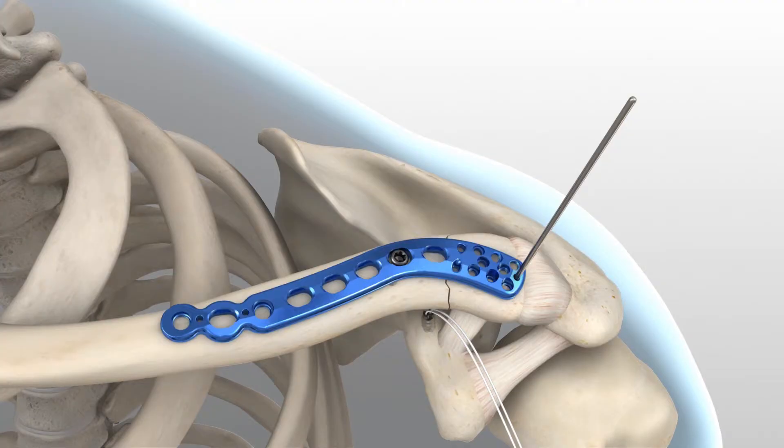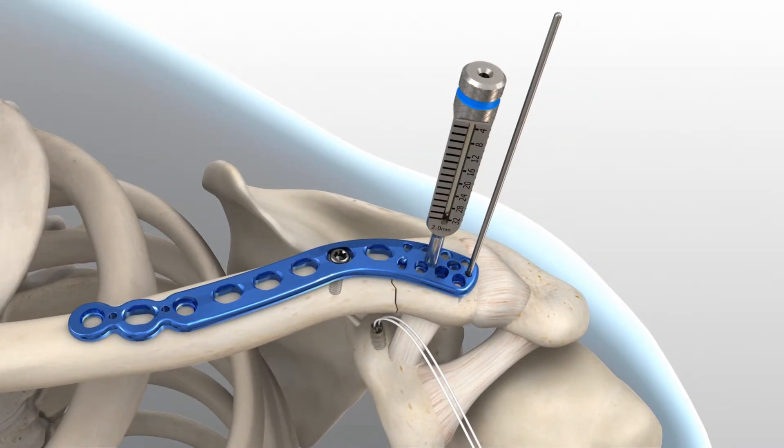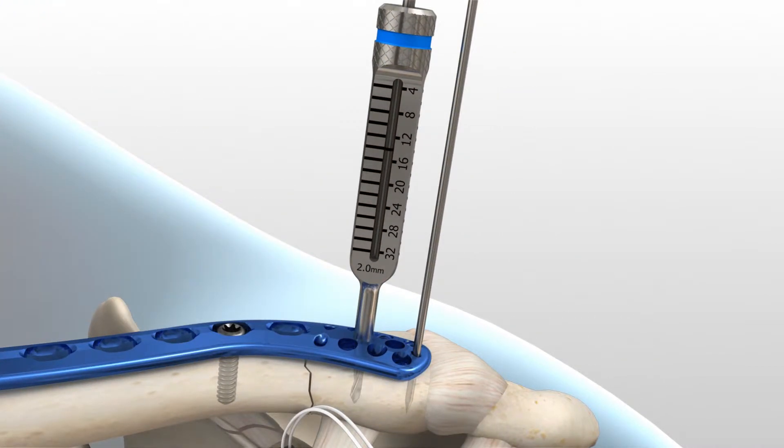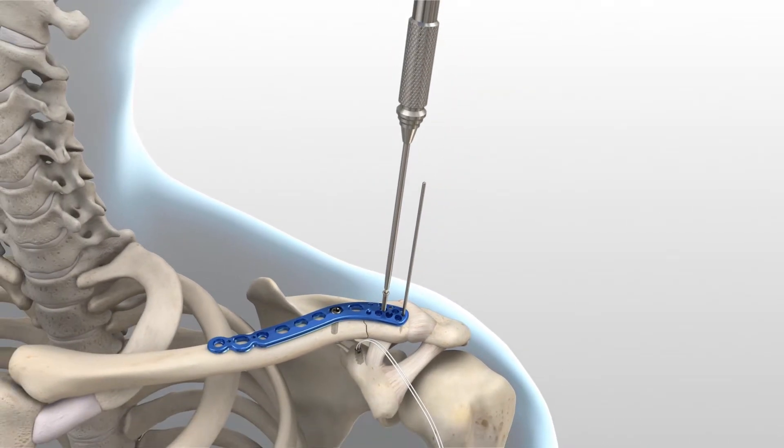To insert the distal screws in the plate, begin by securing the plate to the distal fragment by inserting a 2.3 mm non-locking screw through the medial-most center hole. Place the 2.0 mm locking drill guide into the center hole and turn clockwise so that the guide fully threads into the plate. Insert the 2.0 mm drill and advance to the desired depth. Drill depth is determined by referencing where the laser mark on the drill aligns with the measurement on the 2.0 mm locking drill guide. Remove the drill guide and use the 1.5 mm driver tip with the cruciform driver handle to advance the 2.3 mm non-locking screw until the screw head fully engages the plate.